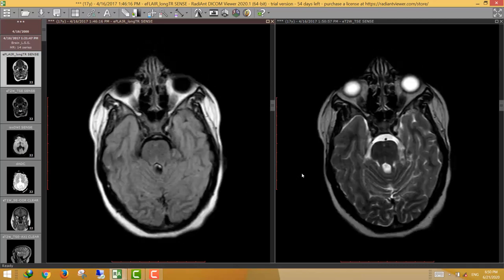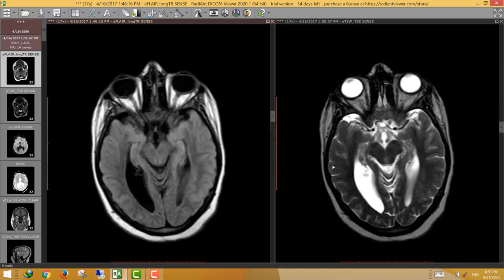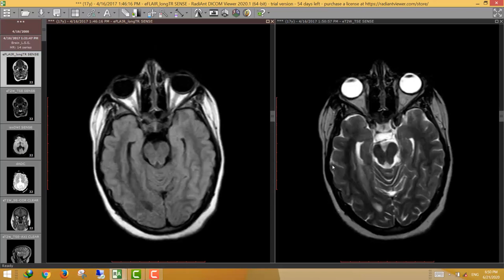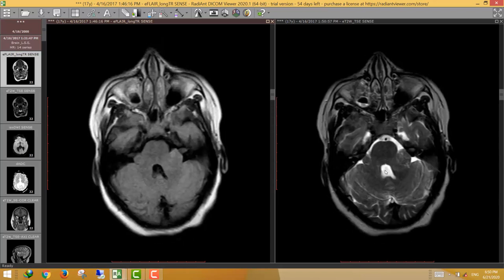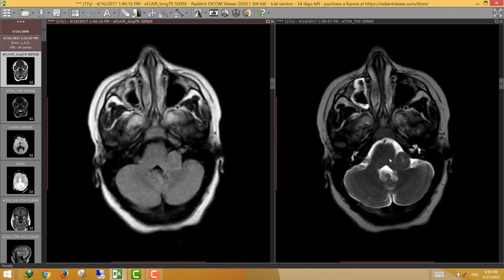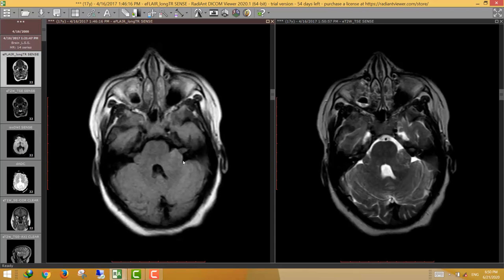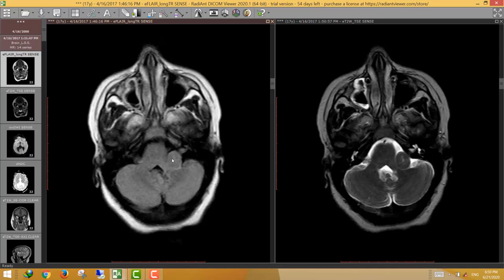We can see different abnormalities. The first abnormality is the presence of bilateral cerebellopontine angle lesions. These lesions are low on T2 and intermediate on FLAIR images.